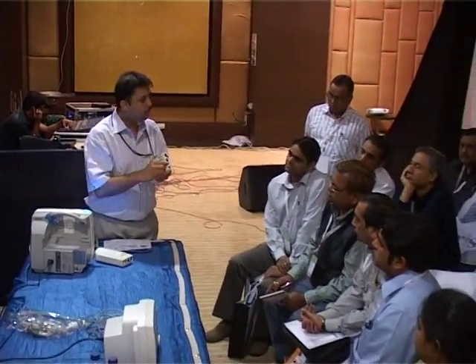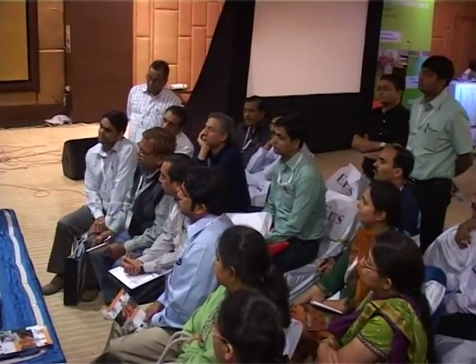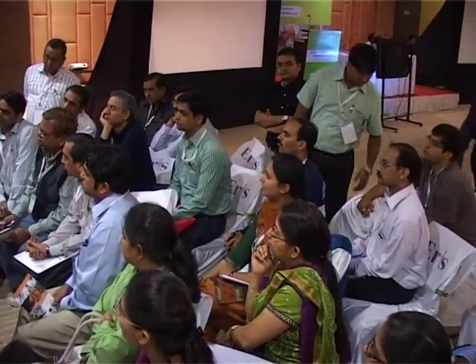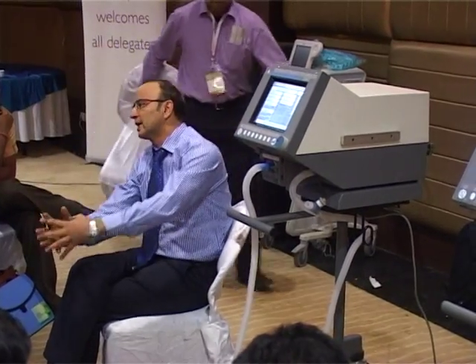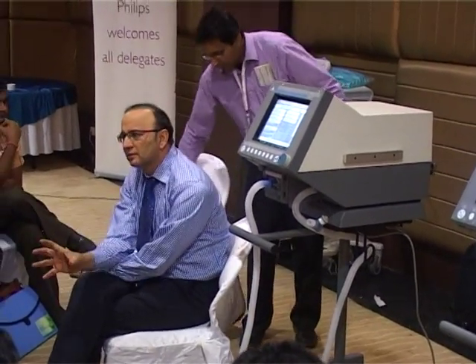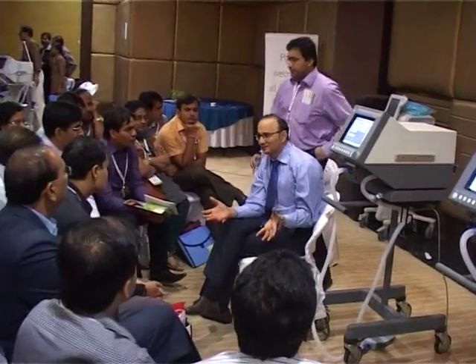So you have a dual combo module because some people still prefer to have a pulmonary capillary wedge pressure and right heart pressures. So we are having both these things together. Sometimes you give breaths with the Ambu bag. The same thing which you do with the Ambu bag is done by the ventilator.